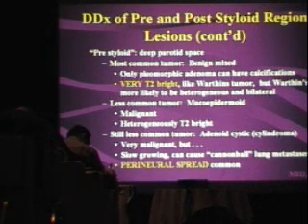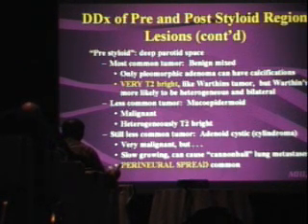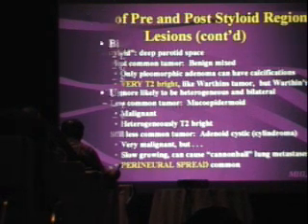All right, so the bottom line is, unless it's multiple bilateral T2 bright lesions and you biopsy one of them and it's Warthin's tumor, or you're following it because you think they may be lymph nodes, pretty much any other parotid single large lesion is going to come out anyway, whether it's benign or malignant.